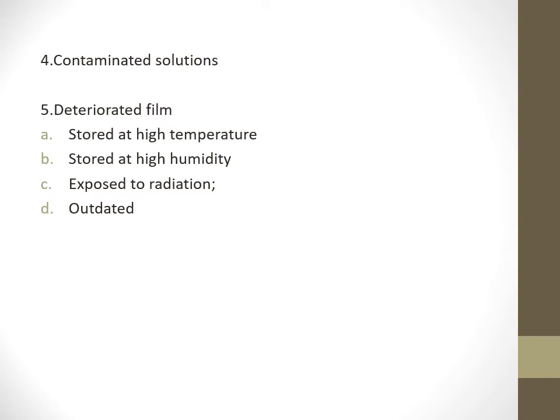Again, we have contaminated solution. Contaminated developer or contaminated fixer can cause film fog. Then deteriorated film: films which are stored at high temperature, films which are stored at high humidity, films which are exposed to radiation, and outdated films.